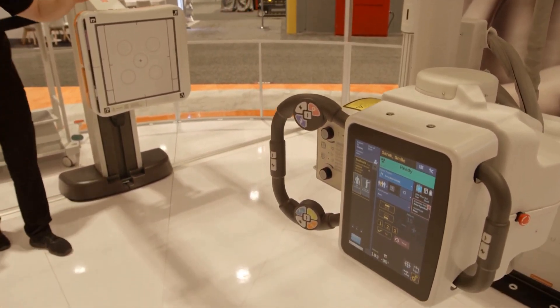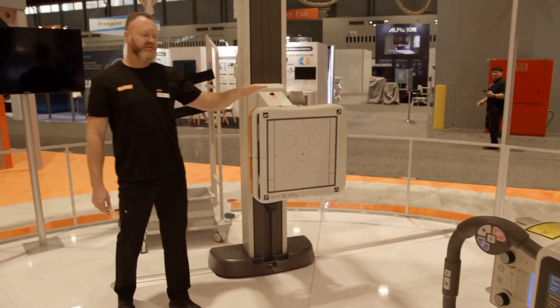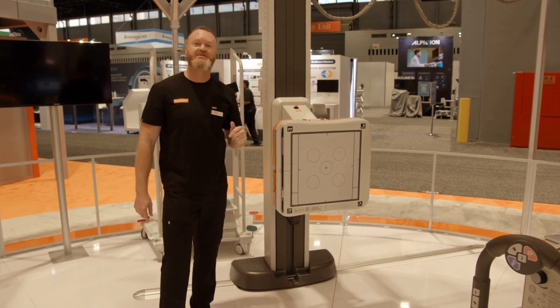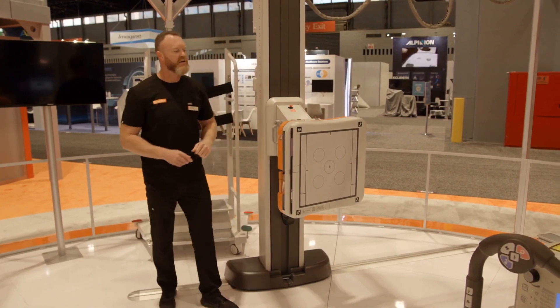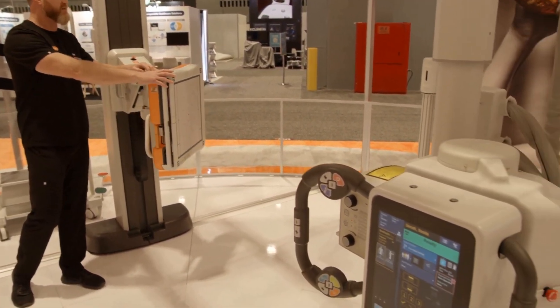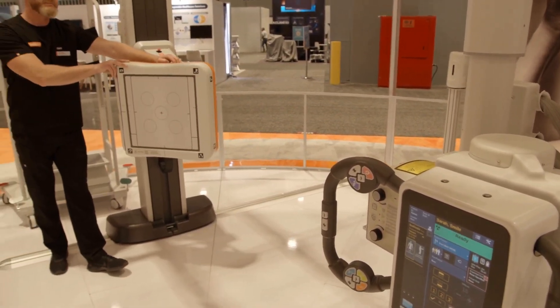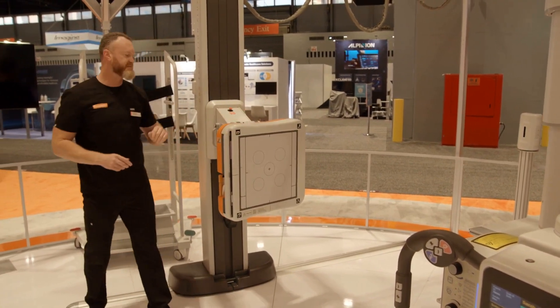We can also reposition our wall stand to tilt or angle. Once we put those tilting angles on there, we can also align the tube to that. I'm going to demonstrate that right now — I'm going to put a 15-degree swing on this wall stand. You can swing it all the way out 45 degrees to the left or to the right. We'll start with just a minor swing here, 15 degrees.